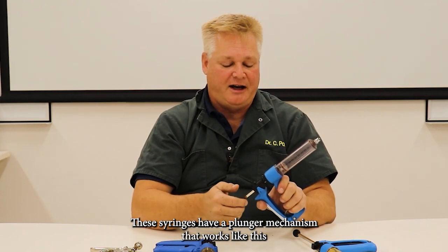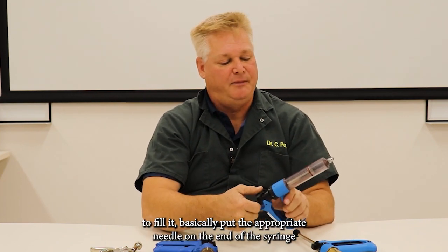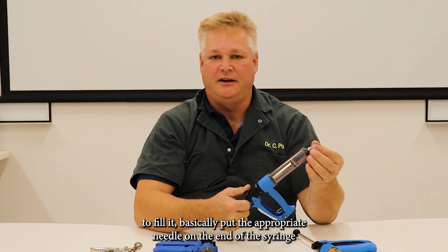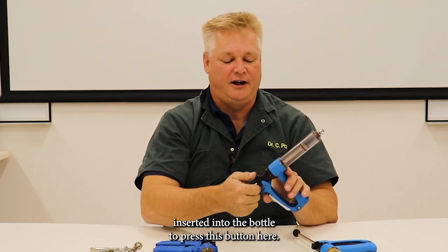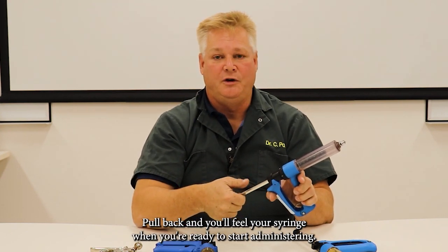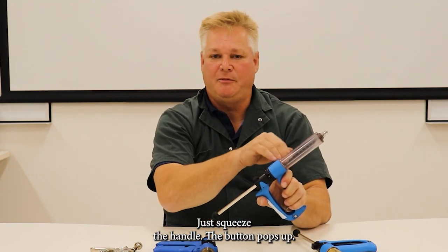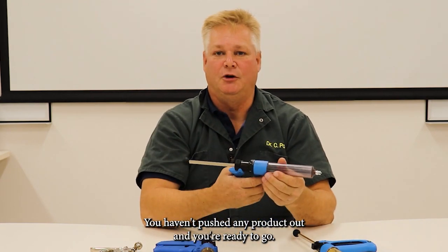These syringes have a plunger mechanism that works like this. To fill it, basically put the appropriate needle onto the end of the syringe, insert it into the bottle, depress this button here, pull back and you'll fill your syringe. When you're ready to start administering, just squeeze the handle — the button pops up, you haven't pushed any product out, and you're ready to go.